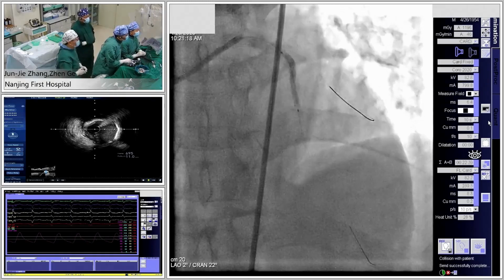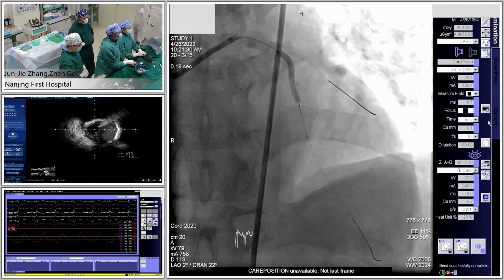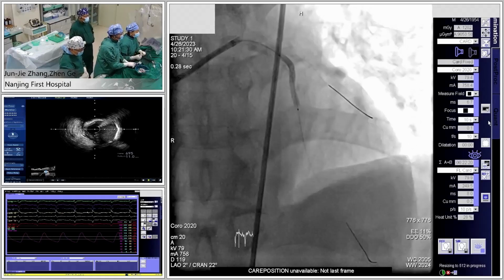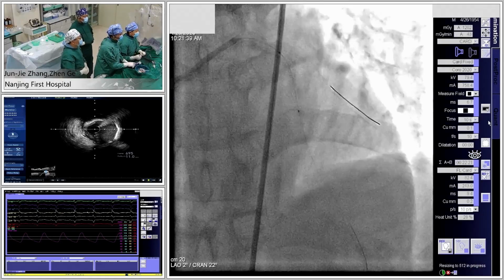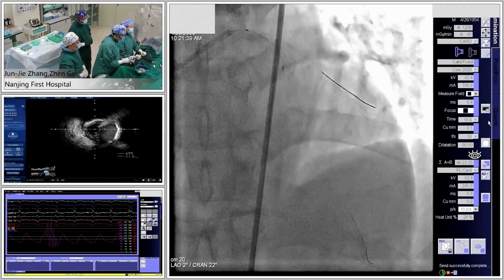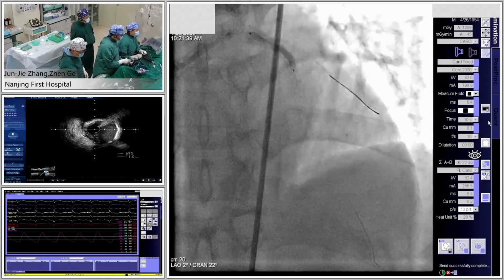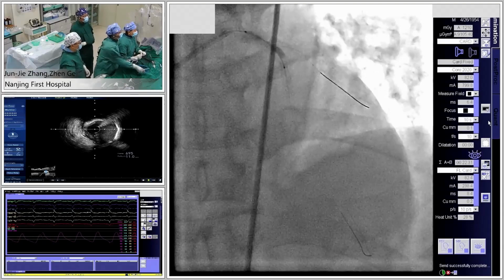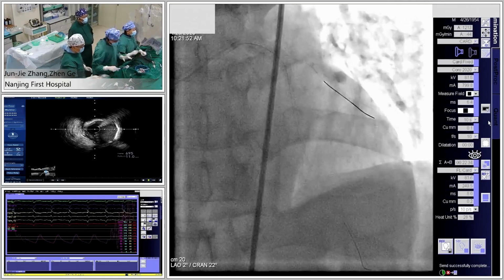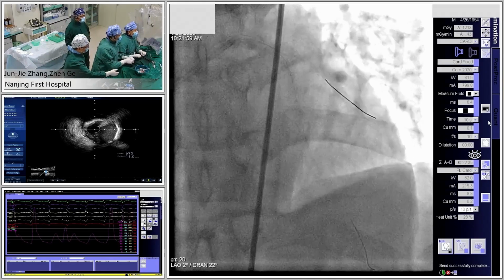For a longer stent, we need a long inflation time to achieve full stent expansion, so at least 15 seconds. Otherwise, the stent will be underdeployed. Maybe we should pull back a little and do the stent balloon post-dilation. The 2.2 stent? Yes. So what's the next step, Dr.